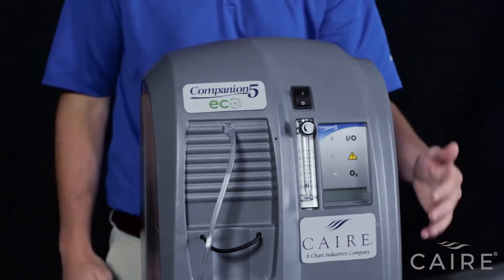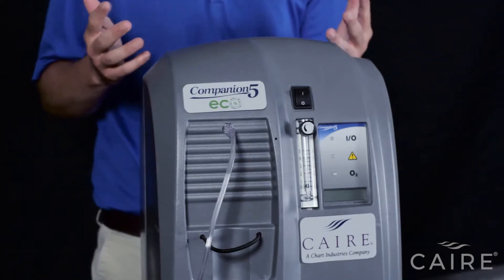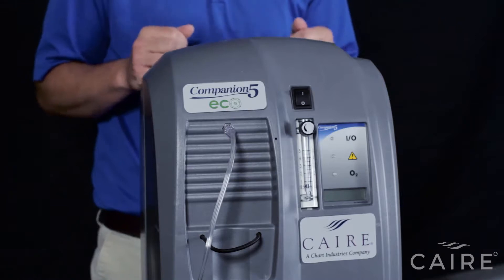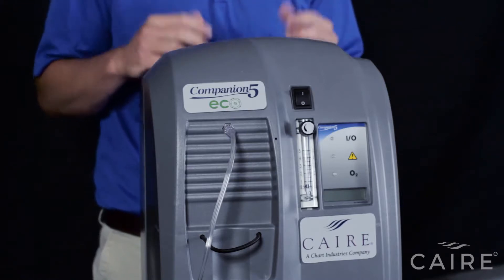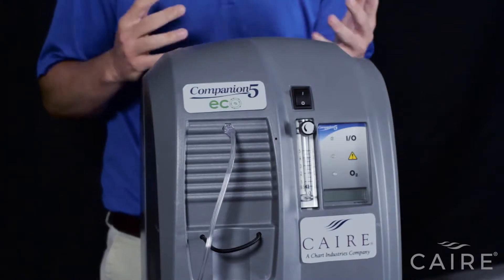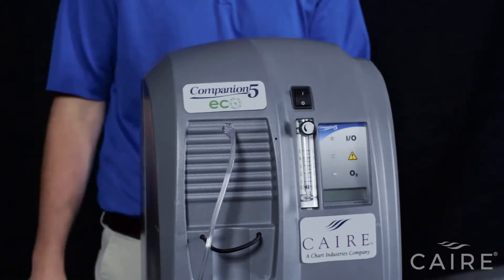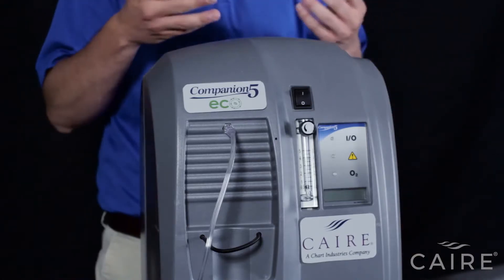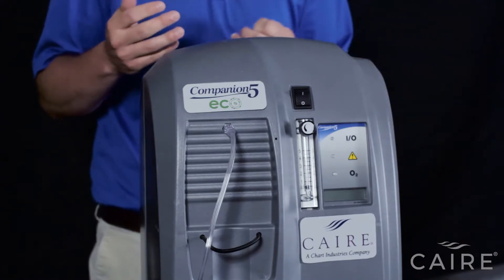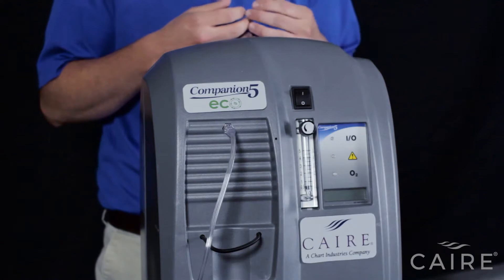The filter on the bottom of the unit is not replaced by the user — it's replaced by your equipment provider or service technician, who will schedule this once every two years. That's the only routine maintenance this device requires, and it can be accessed without opening the case so they can do it in your home. If you need to clean the device, don't spray liquids directly onto it. Spray a mild bleach or household detergent onto a cloth and then wipe the cloth onto the unit to make sure no water ingresses into the machine.